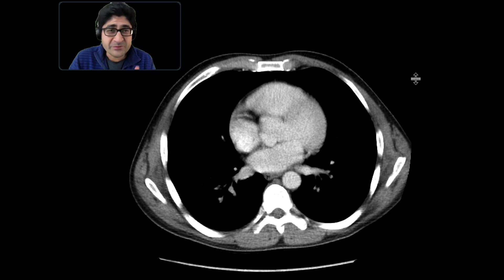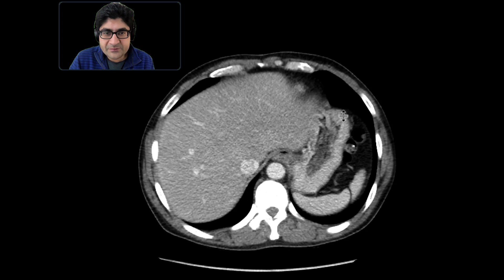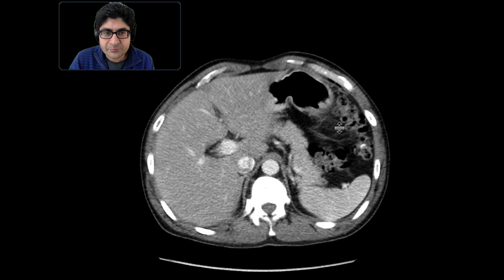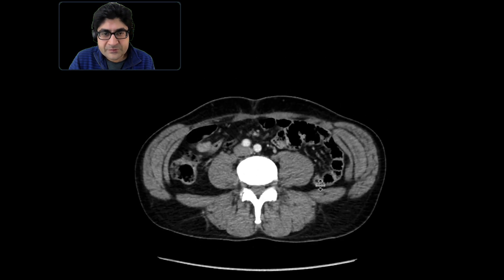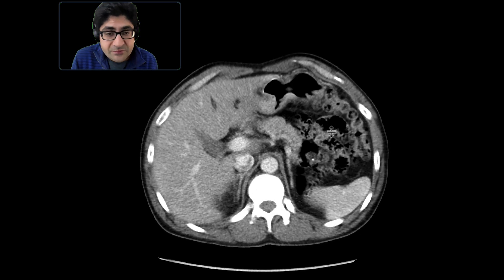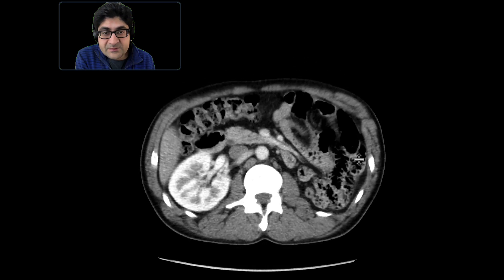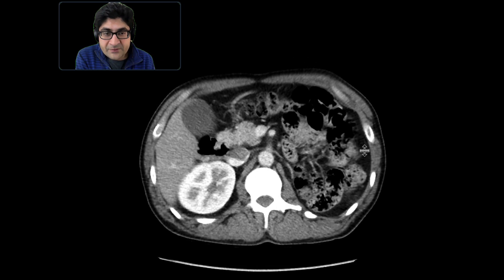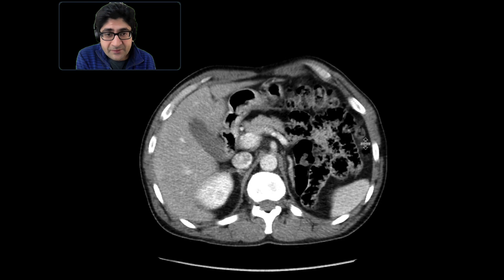This is a patient who comes in with nonspecific symptoms of abdominal pain and bloating. We got a CT scan with intravenous contrast to figure out what was going on. As we scroll downwards, the left kidney is missing. The question is whether this is congenitally absent or post-nephrectomy. I'll tell you this is a patient who had a congenitally absent left kidney.